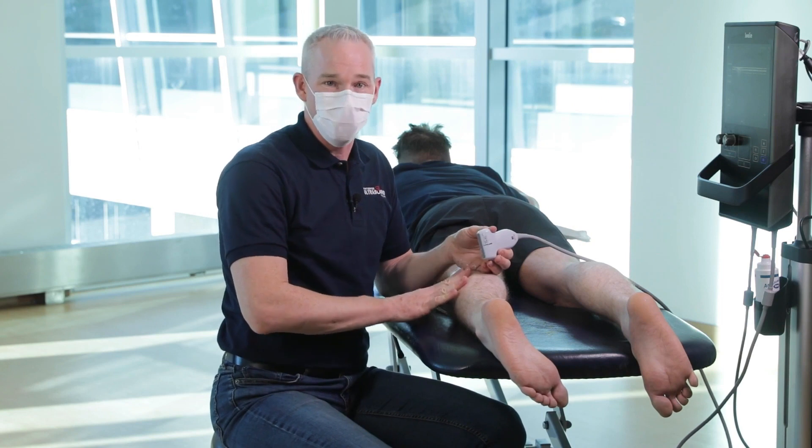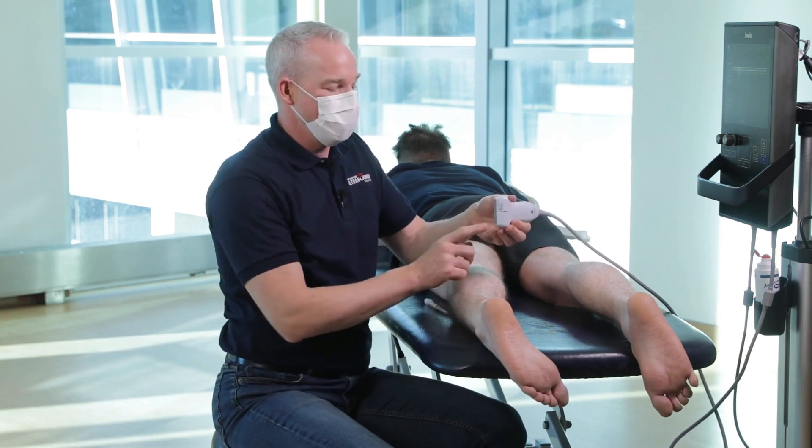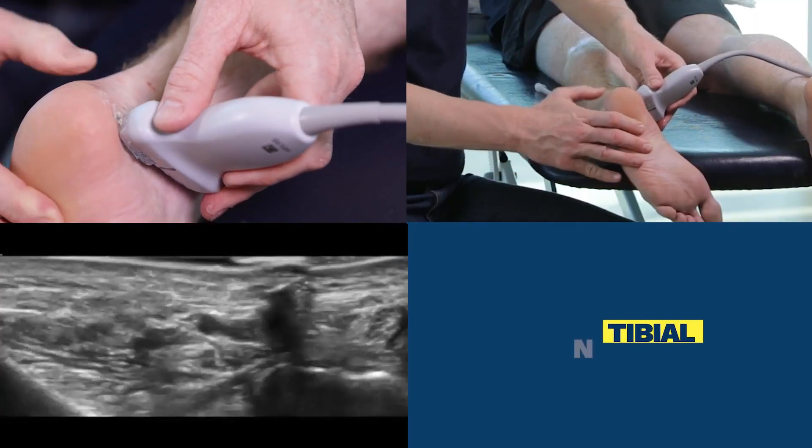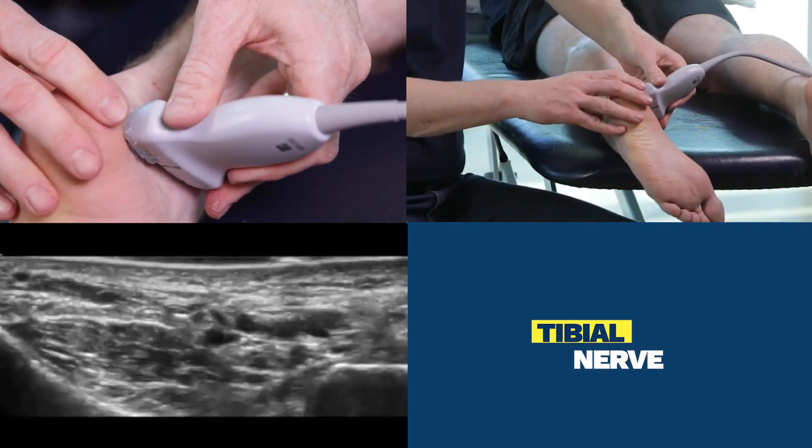Patients should be prone. Your landmark is going to be the medial malleolus of the tibia. The other end of the probe is angled towards the calcaneus.